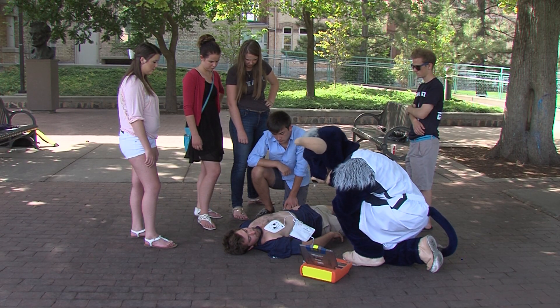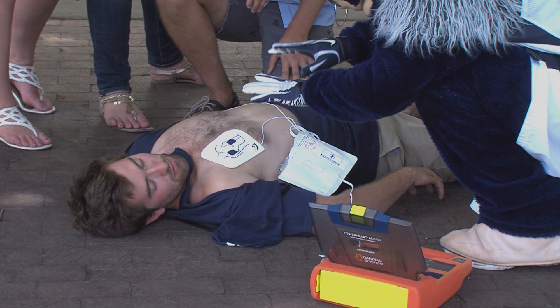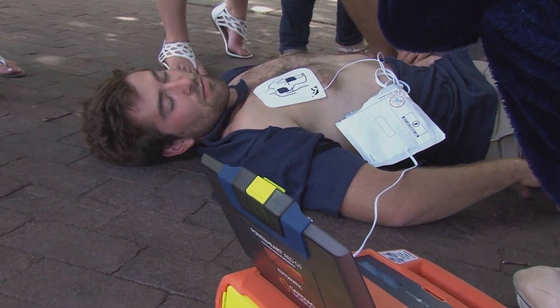Do not touch the patient. The AED will analyze the rhythm and continue to instruct you on how to take care of the victim. The sooner you attach the AED, the better the chance for survival.